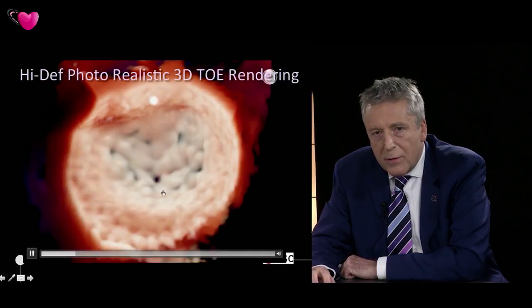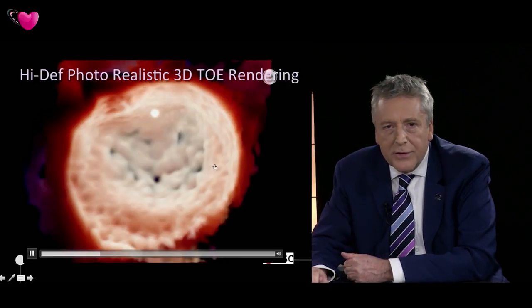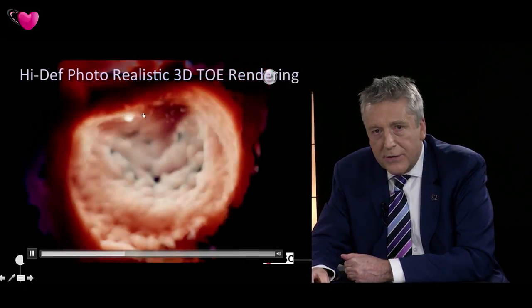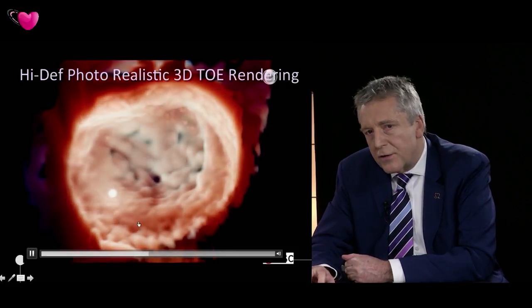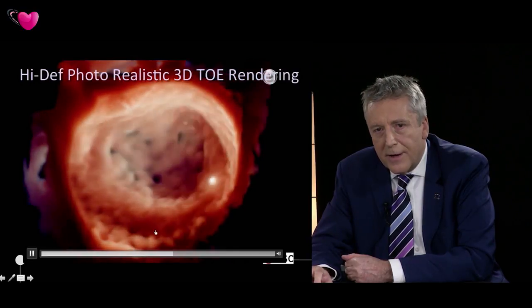And in this case, we really want to look in detail at the mitral valve annulus, as you only know too well, Stefan. And so this is the light source, which I'm going to move around the annulus. And you can see as I track it round, we can see in detail the structure and the anatomy of the mitral valve annulus and also the mitral valve leaflets here.